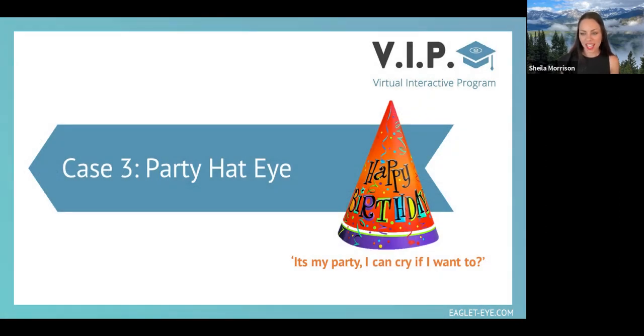This is one of the most common patients that I see that present great challenges. Eyes that are shaped with a steep proud graft that have a high elevation centrally, with likelihood of having close to touch in that mid-periphery and then drop off with edema.